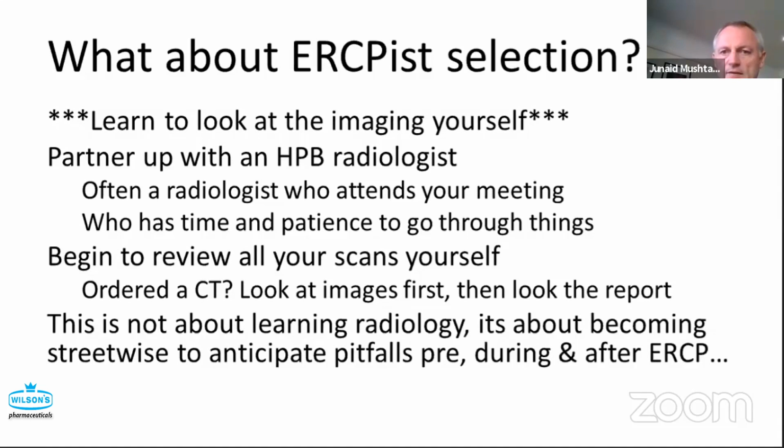And so I think for people who are trainees and early service providers, getting into the routine of reviewing all of the scans yourself is, I think, a very, very important step forward. And certainly something I would be keen on if they're about to do my own ERCP on me. And I think one way to do this as we are in training doctors is if we ever order a CT for our consultant on the ward, then when it comes back, before the consultant comes, look at the images first, then look at the report and start to see what the radiologist sees.